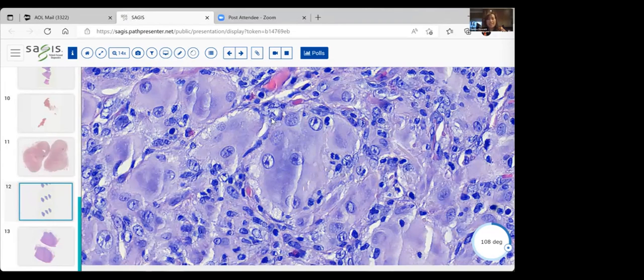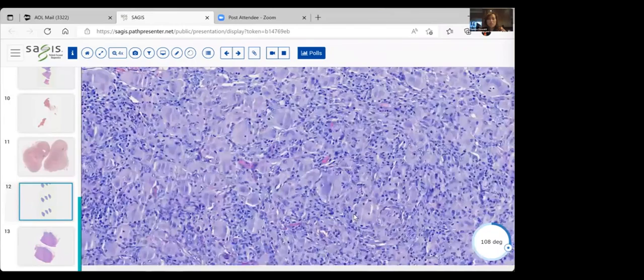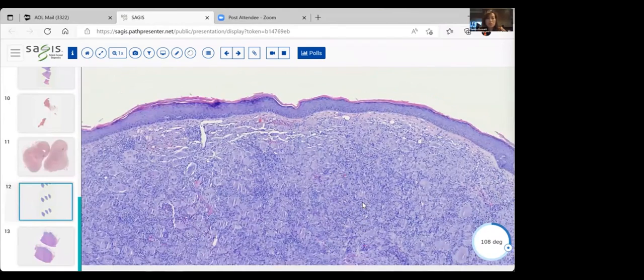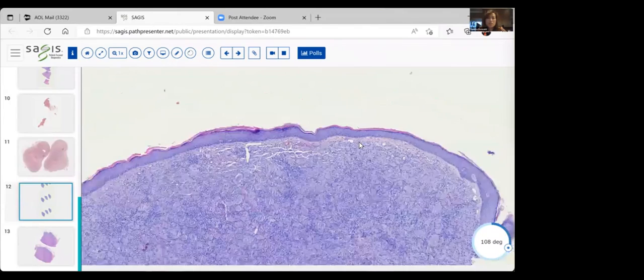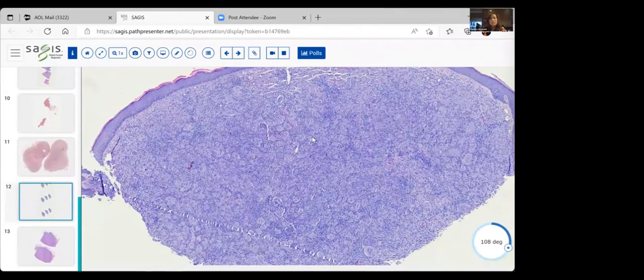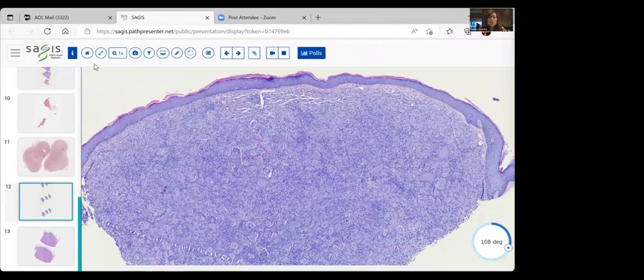But the key and the clue to this diagnosis is going to be these two-toned histiocytes. Okay, so I love this example. Again, beautiful example of reticulohistiocytosis. I think this was called a reticulohistiocytoma. So I'm assuming this was a singular lesion in an individual. Look, a little bit of nice shadow here. But look carefully at those cells if you want to compare them again across the other giant cells we've looked at today.